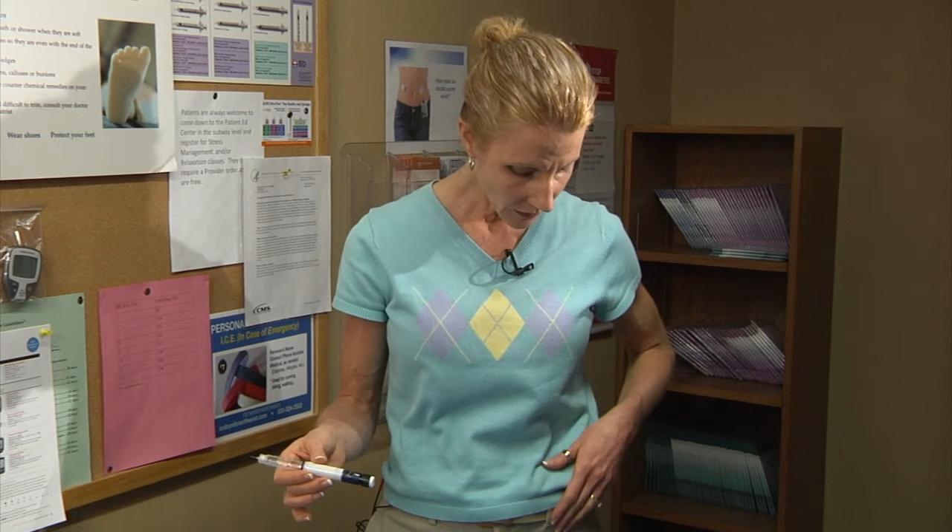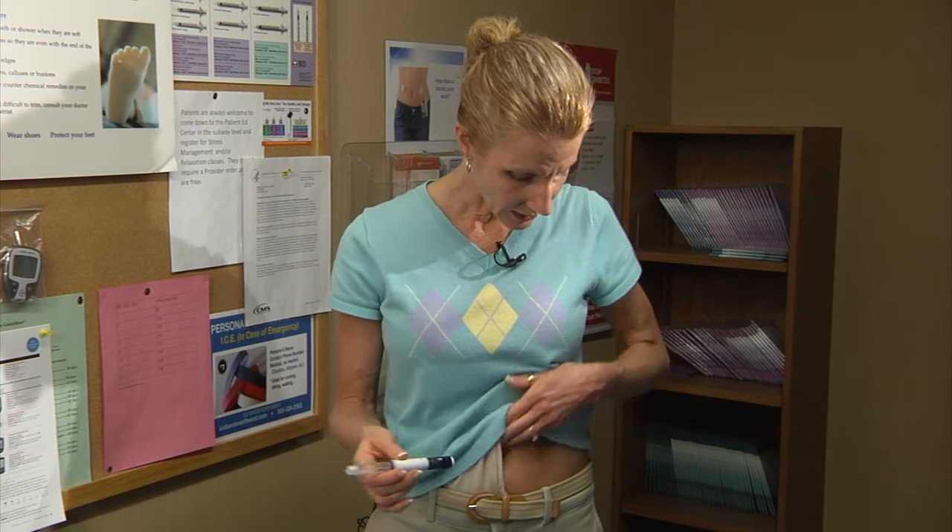The preferred site for insulin administration is the abdomen — from your rib cage to your hips and as far laterally as you can comfortably reach. You want to rotate sites so that you're not returning to the same couple of places again and again. You should be about two finger widths away from your belly button.